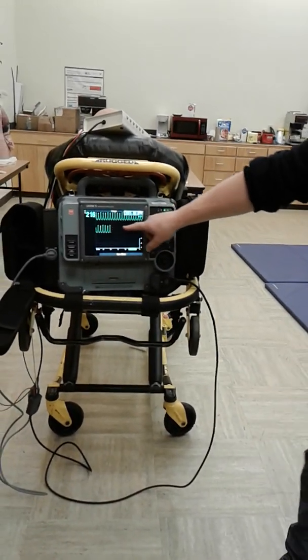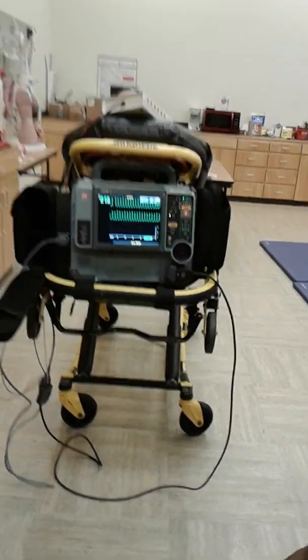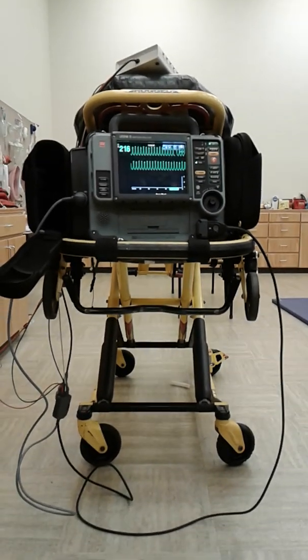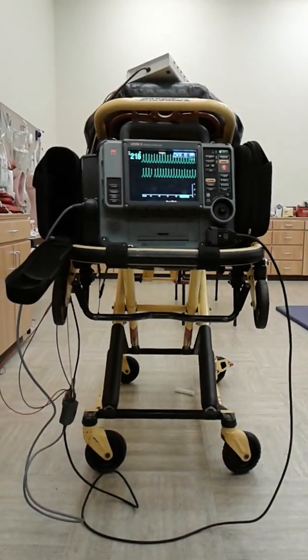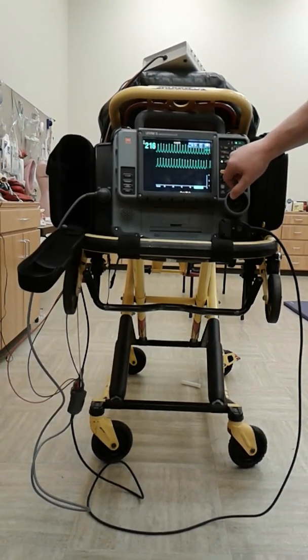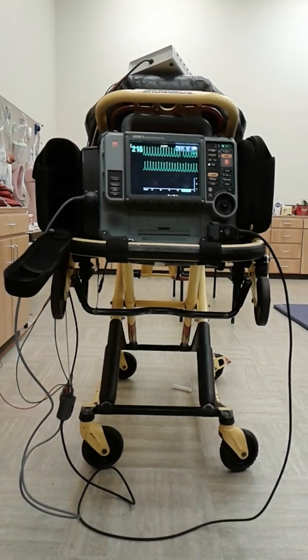All right. So we see right here, see those little arrows that pop up? What that arrow is marking is every time that R wave fires. Did I say that? You agree with that? All right. So what you're going to do is you want to make sure that light is flashing sync, and we've got those sync markers up there.